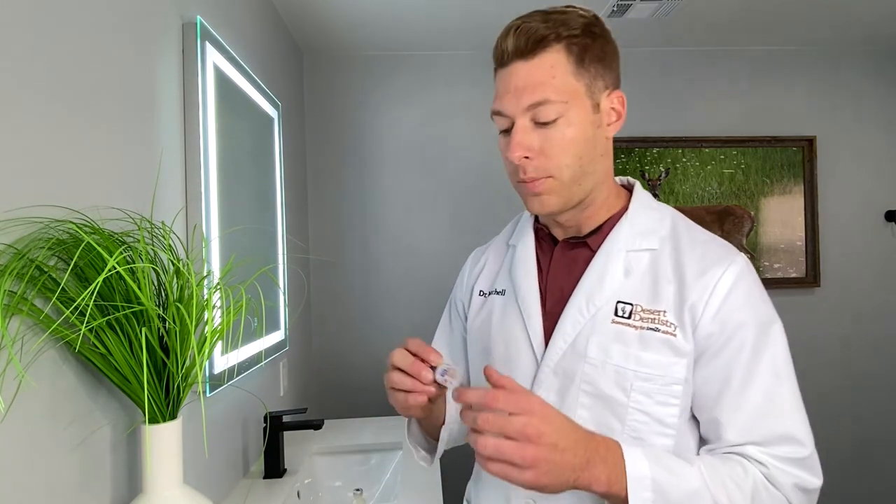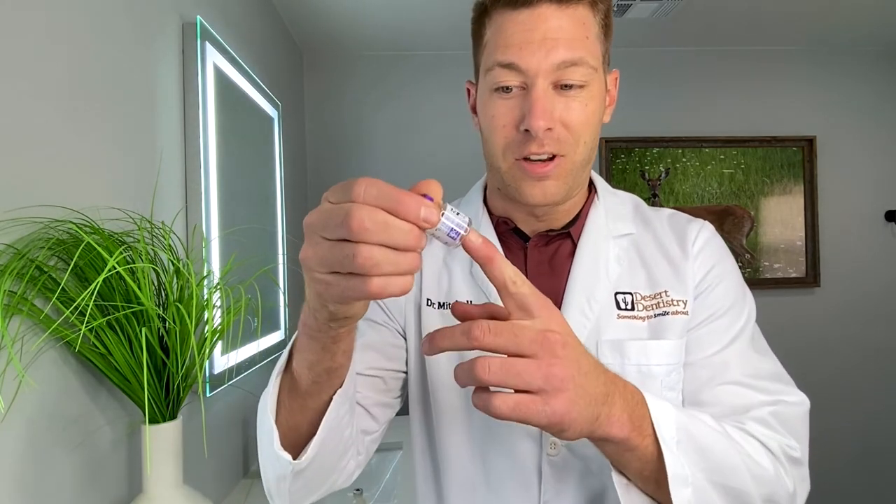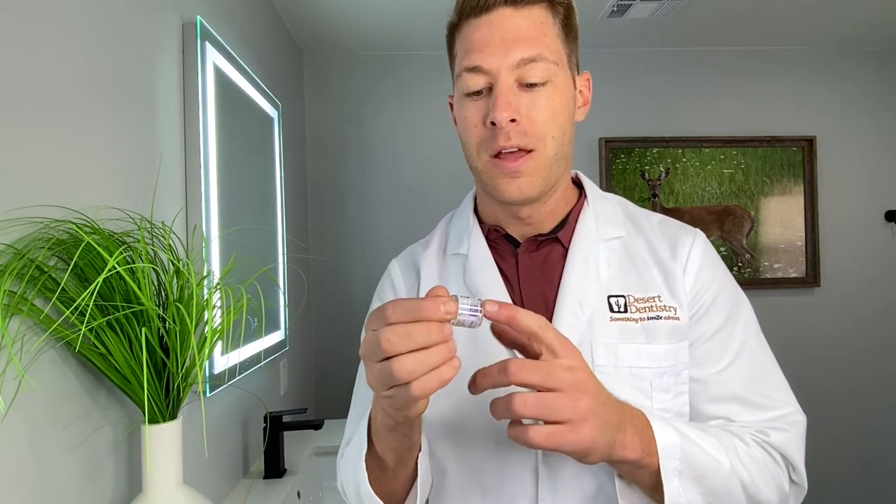Now that you've learned the mathematics behind mixing Botox, I'm going to demonstrate it and give you a few tips and tricks I've learned along the way that will really help you do this for your patients, friends, family, and staff. First, I start with your Botox — it comes in a vial like this, a 100 unit vial. When you get it, it's going to look like it's empty — just a small powder of Botox at the very bottom adhered to the glass. Don't worry, this is where the math comes in.